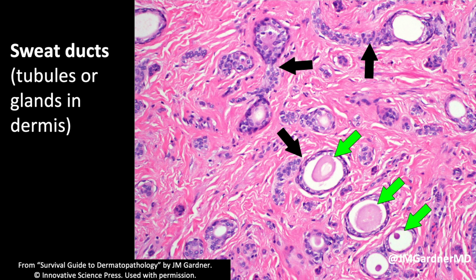This is a syringoma, and this one shows actual tubules that are suspended in the midst of the background dermis, kind of surrounded by sclerotic collagen. So this is a different pattern. Sometimes you'll see a large cellular mass with little duct spaces like I just showed you in that poroma or that spiroadenoma. And then here, though, other tumors actually make distinct tubules that kind of trickle in between dermal collagen. So there's kind of different patterns, but still it's making a duct.